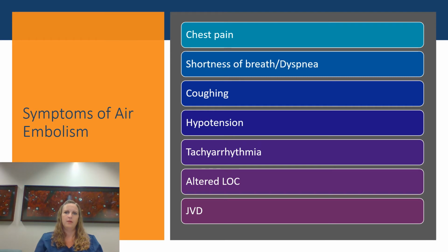An air embolism is when air enters the venous system through an open catheter. This can happen when catheters and lines are not primed prior to insertion, when the catheter lumens don't have those little connection caps, those clear links at the end, also during deep inspiration when the line is being inserted or removed, and also if there are any cracked hubs and catheter fractures.